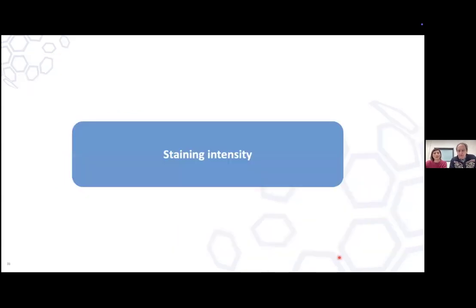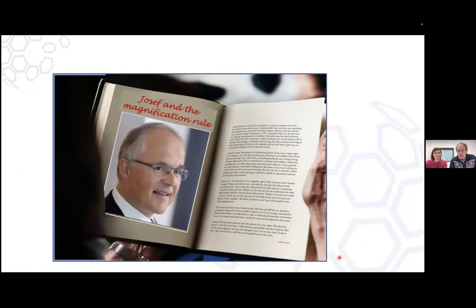Okay. Staining intensity. That's my favorite part of the talk. This is my friend Joseph Ushoff, and his magnification rule. I'm not sure that it is his magnification rule, but definitely his insistence has created the fact that we all use it, you know? And so, make people aware of it.